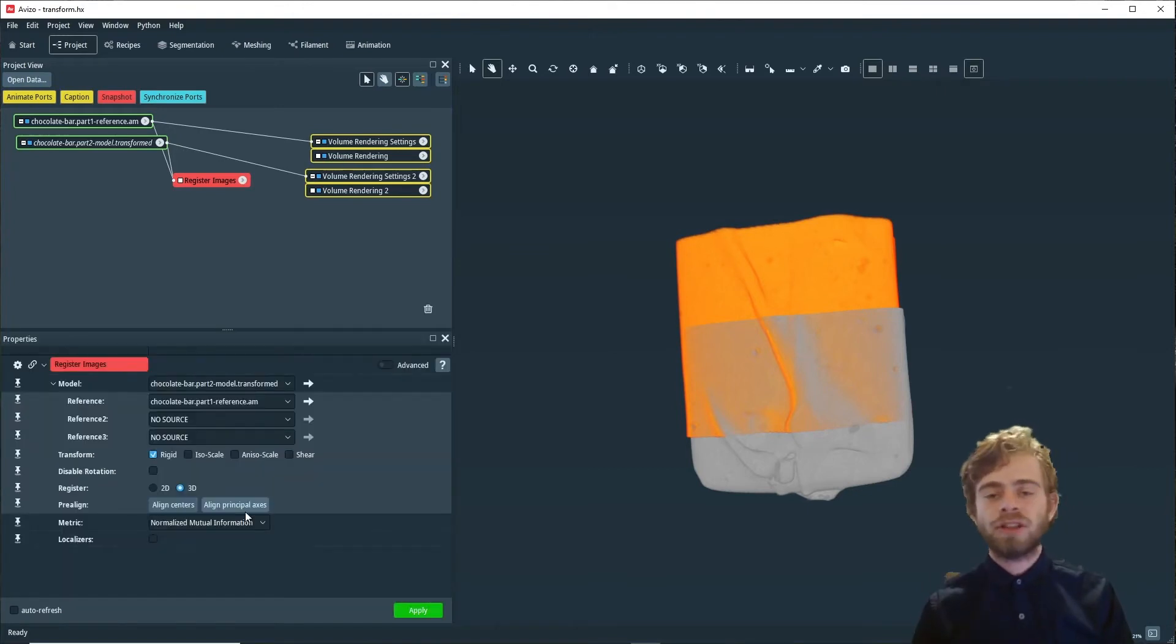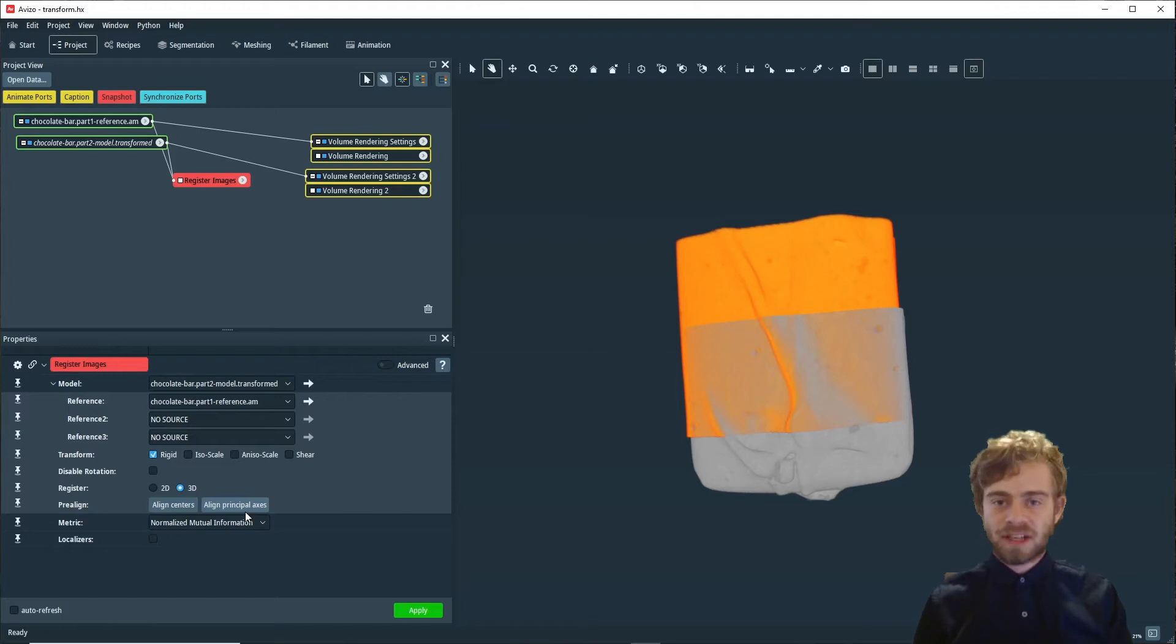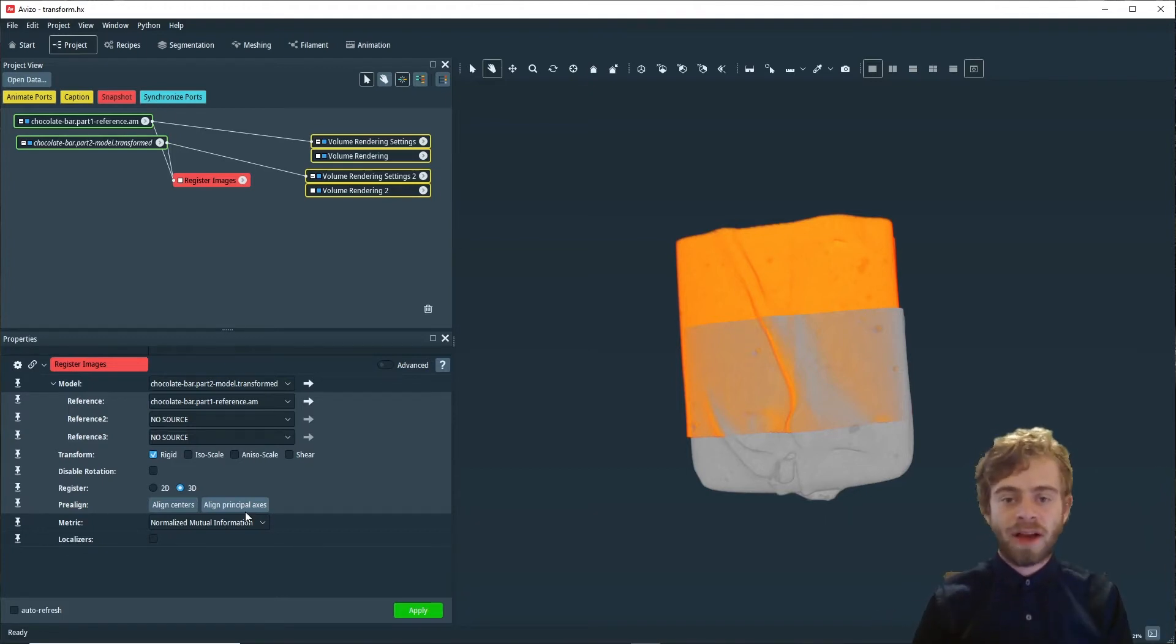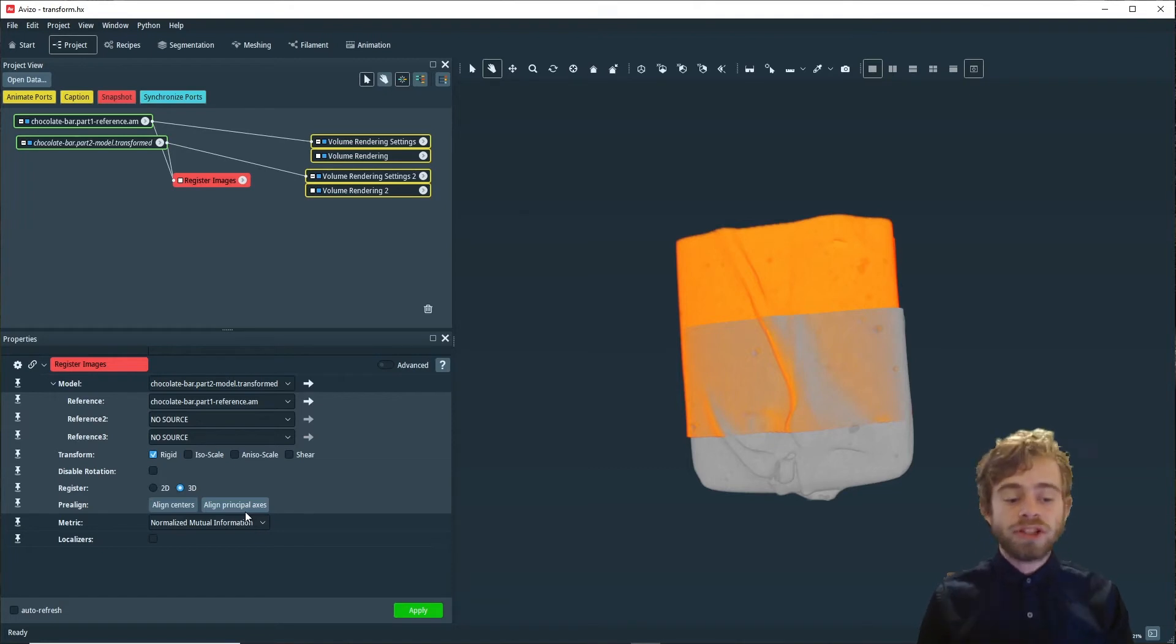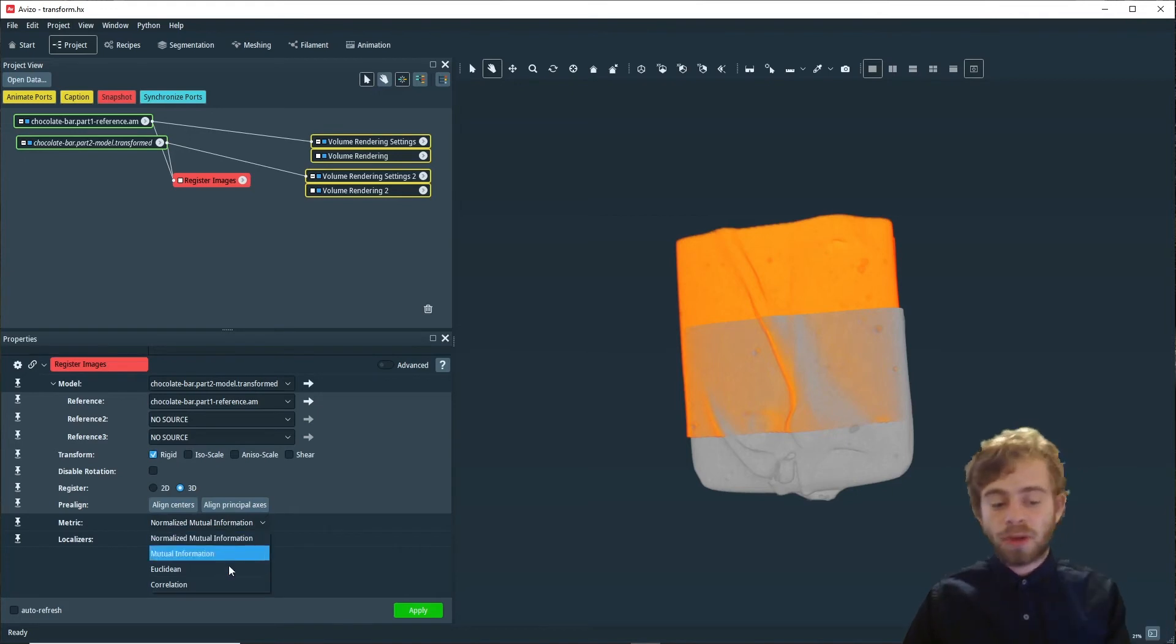The register images module automatically aligns two datasets by the optimization of a quality function that measures how well the two datasets are aligned. You can change the quality function right here and change it from normalized mutual information to another metric.